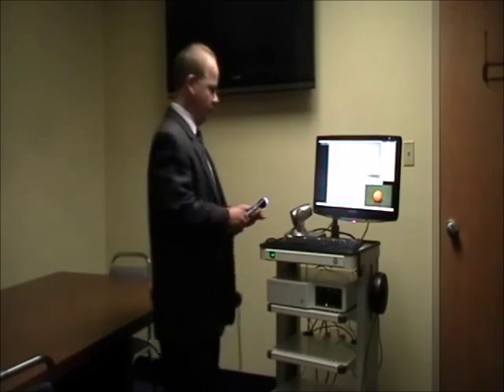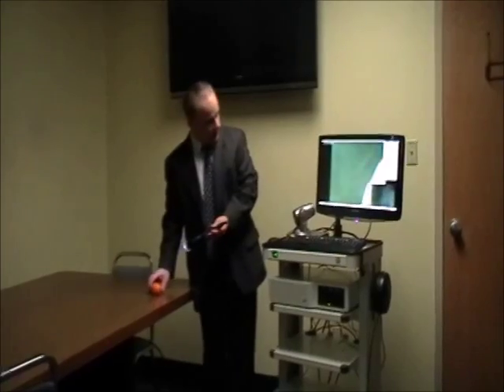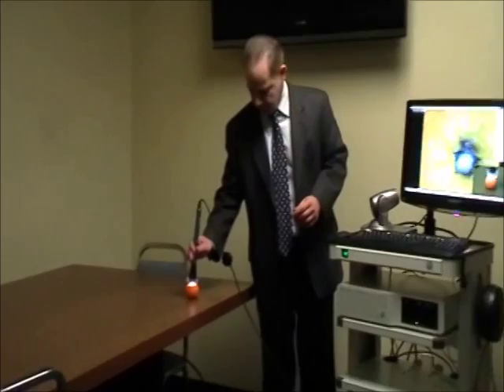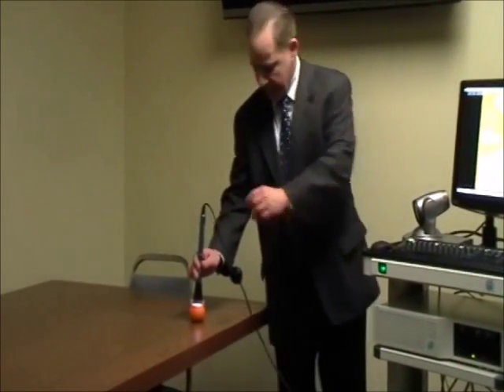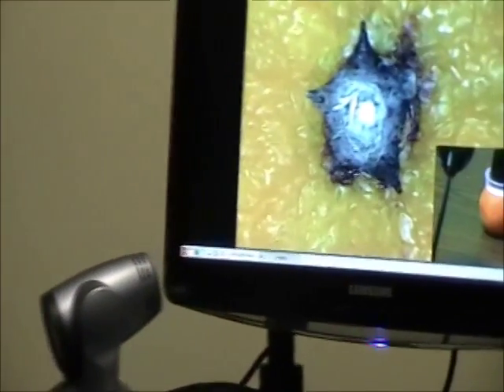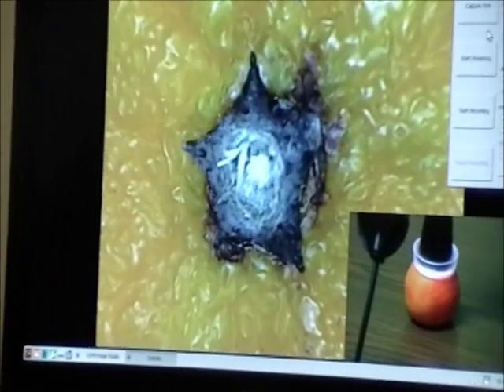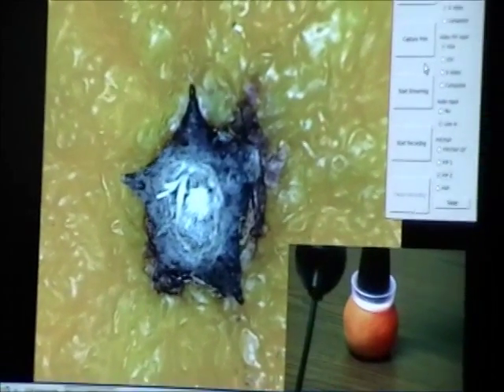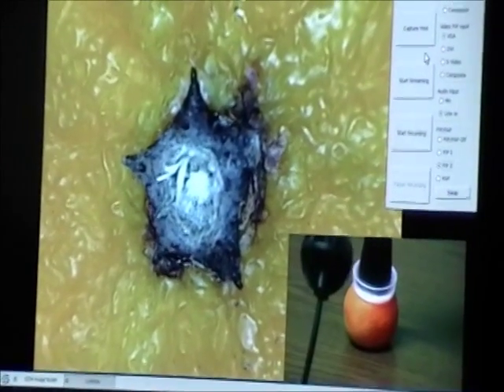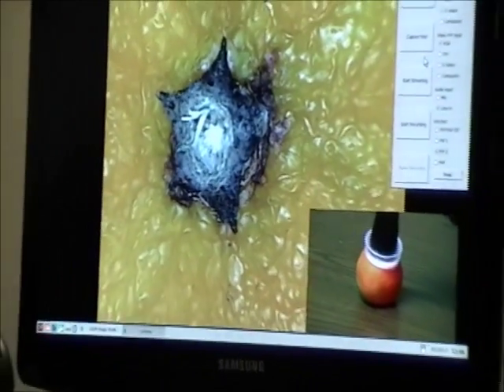Let's go ahead and use this with the patient now. Patient being our orange. So we can now see that we can put this camera directly on the patient's skin, for instance, focused for super high detail, while at the same time our more wide view cam, which is again getting our 3 to 6 inch out type view over here, can actually give us a good sense as to where we are in relation to the patient itself.